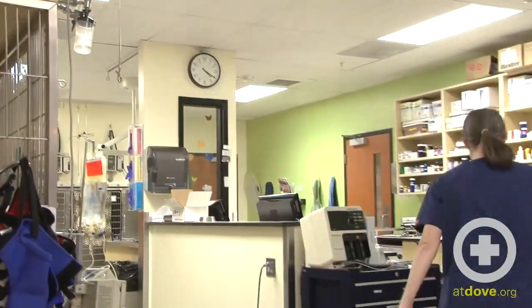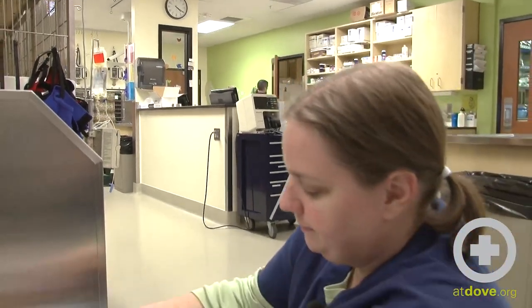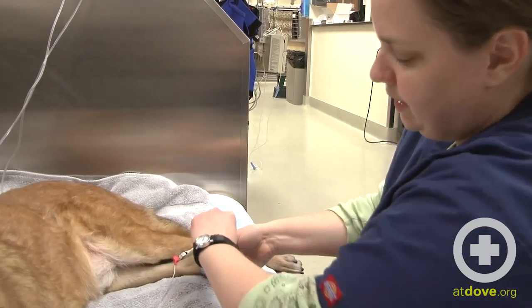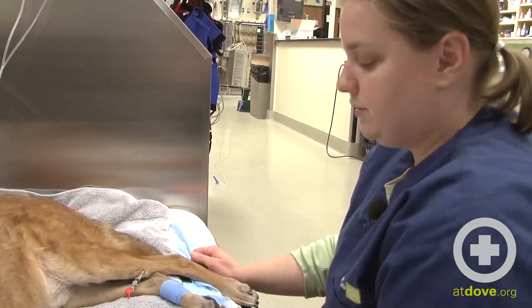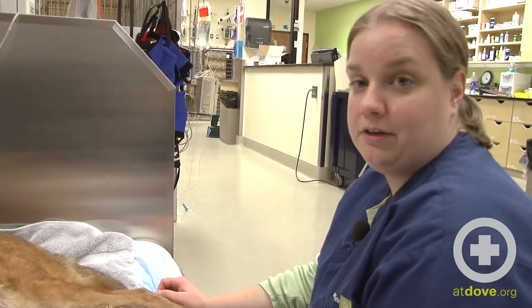You don't want arterial samples to wait very long — again, you don't want them to mix with any room air. I'm just going to apply some pressure over this artery. I'm going to put this bandage on a little bit tighter than I would if this were a vein, and leave it on for about two minutes and then remove it. Hopefully this artery will be useful to us again if we need to recheck. And that's how we get an arterial blood sample.